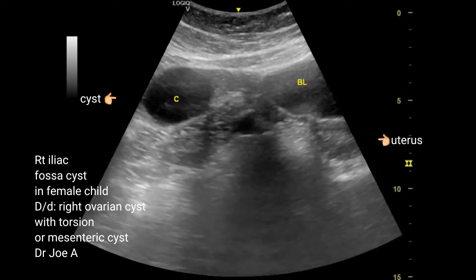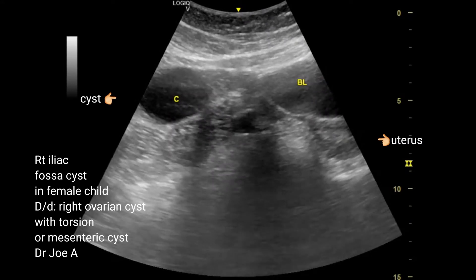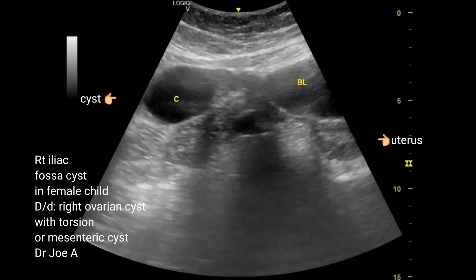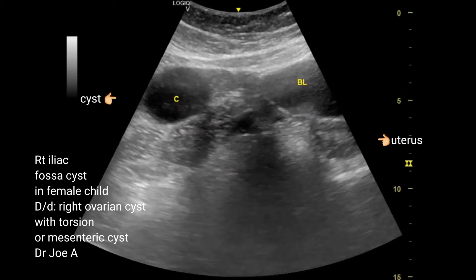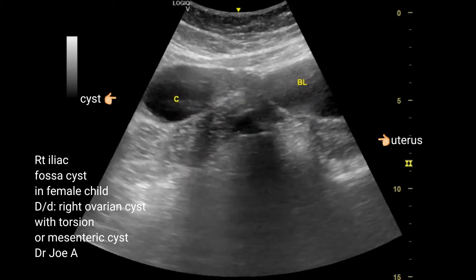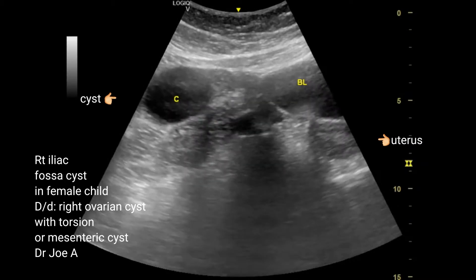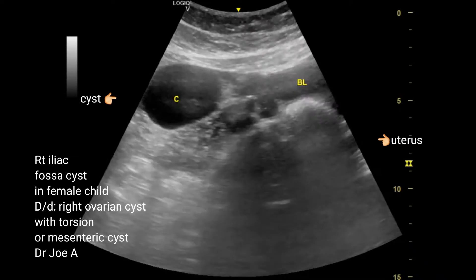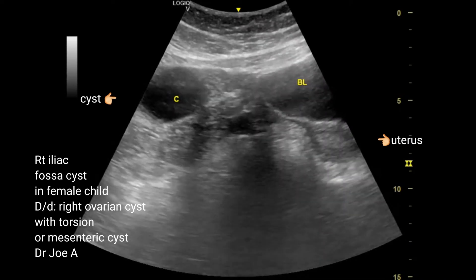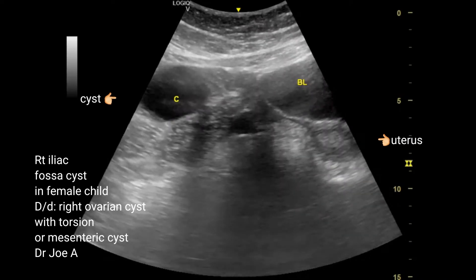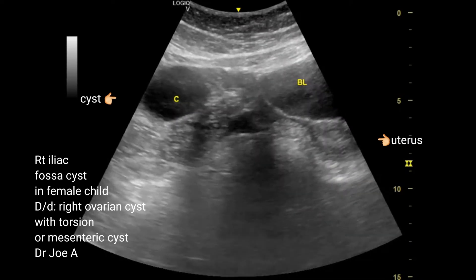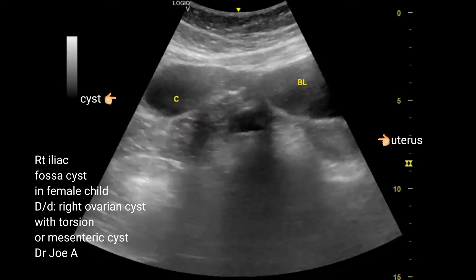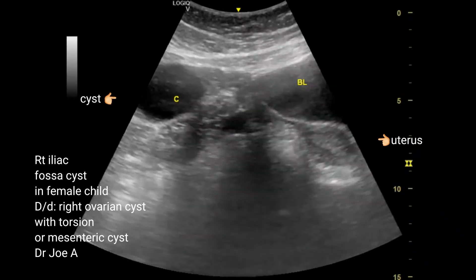Ultrasound shows a simple cyst, possibly related to the right ovary or para-ovarian elements. It is possible that the ovarian cyst has a peduncle with torsion of the cyst. The other differential diagnosis in this case is a mesenteric cyst.